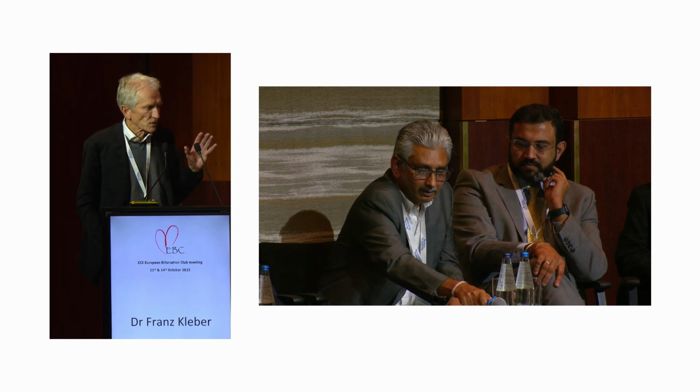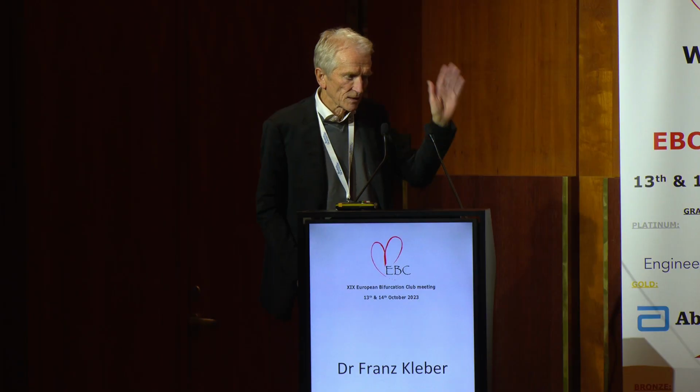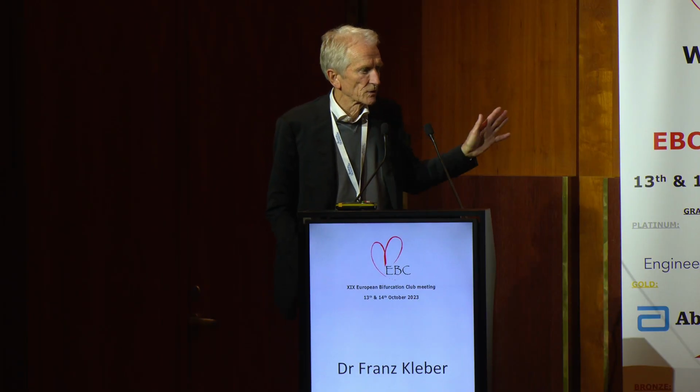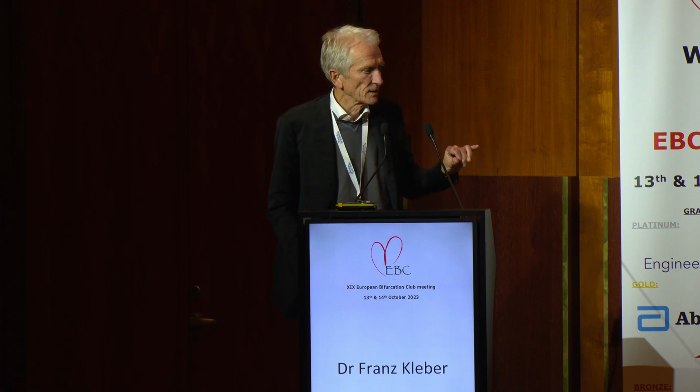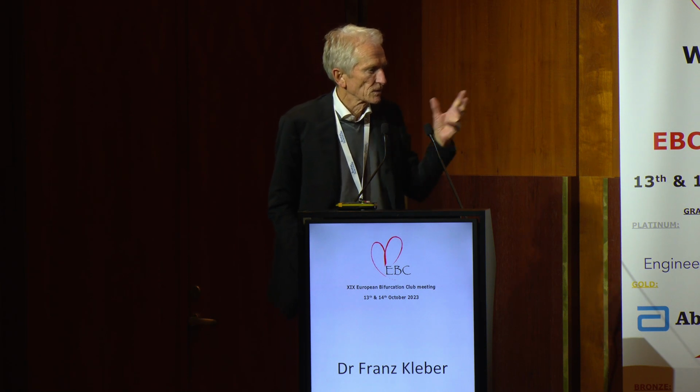I agree, not for the side branch only. The side branch only, I think, is clearly shown in two randomized trials. We don't need anything for the side branch, but we need for the procedure itself. Do we need a DES in the main branch, or should we not use a DES in the main branch? And what does this do to the bifurcation and to the plaque shift and all these things? I think this is important.